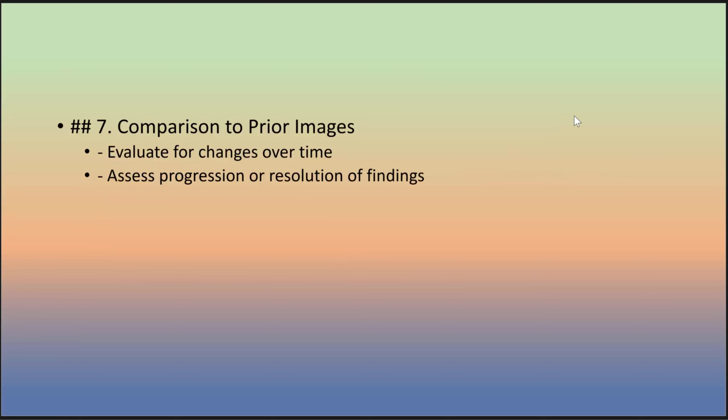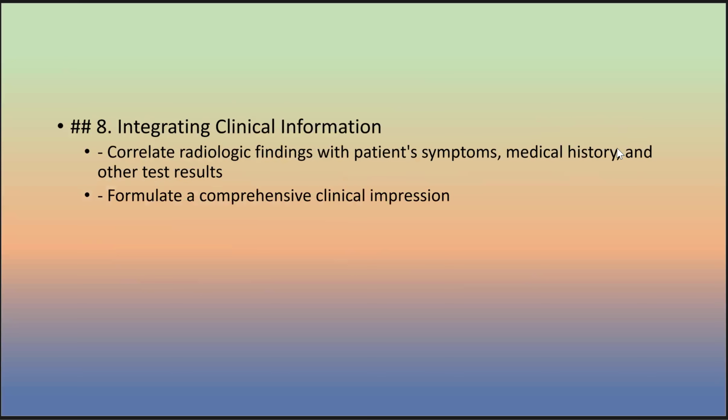Comparison to prior images: evaluate changes over time, compare with previous imaging, and assess the progression or resolution of the findings if there are previous X-rays.